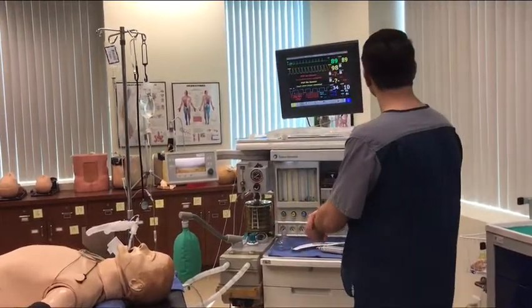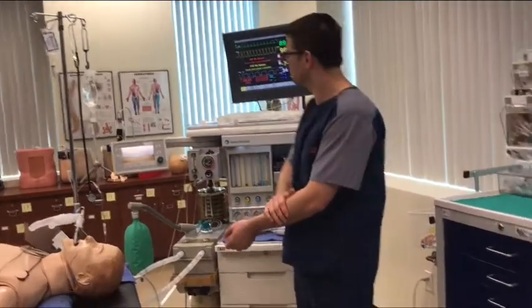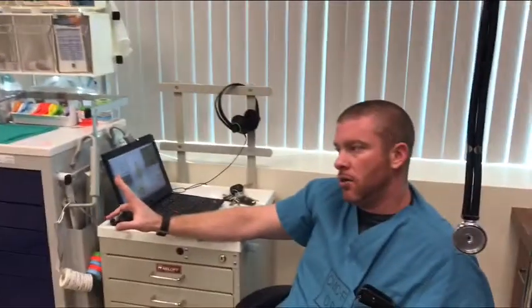Real quick, I wish to add to this. This is a fine balance. When we're blowing off this gas using the mechanical ventilator, which is what you're doing right now, which is great, sometimes we'll increase the volume and the rate, so we're going to sacrifice the CO2.